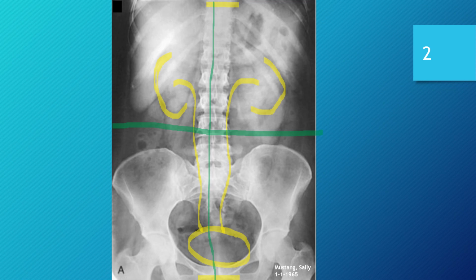It is centered very well. The only thing I would say is it looks like perhaps the patient's shoulders kind of favored the left side just a little bit, and that's because there appears to be on the lateral margins a little more space on the presumed right side than there is on the left. So not really a detriment to this image, but it is apparent.